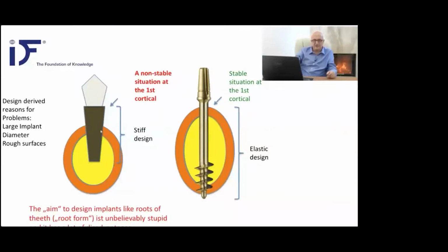These implants were designed to copy the roots of the teeth. And of course, if you copy something, you're going to have the same problems in the end, and these implants have the same problems. This is the reality.